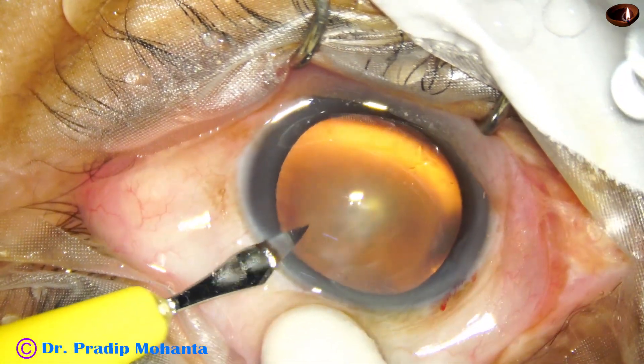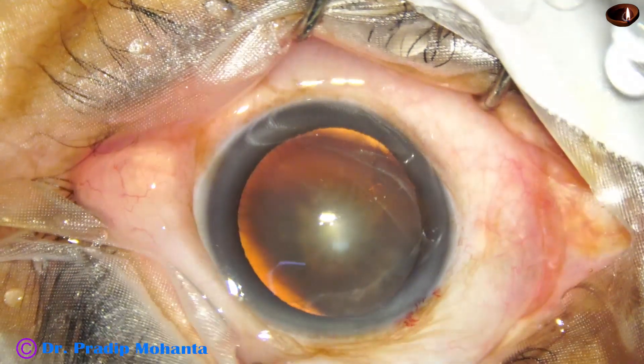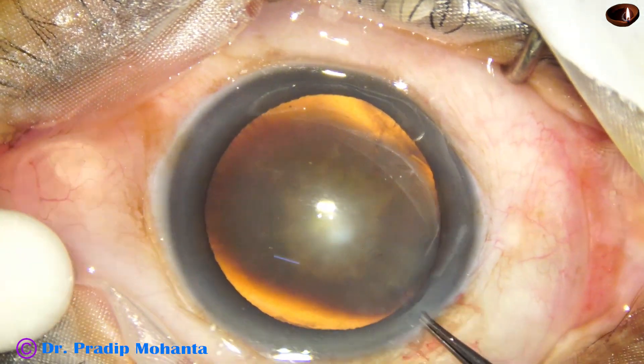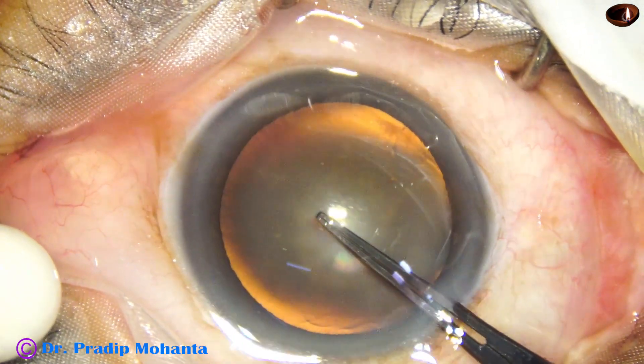We have started the surgery. The main incision has been made. This is the side port on the left side of the main incision, and now capsulorexis is done with the help of a Utrata forceps.